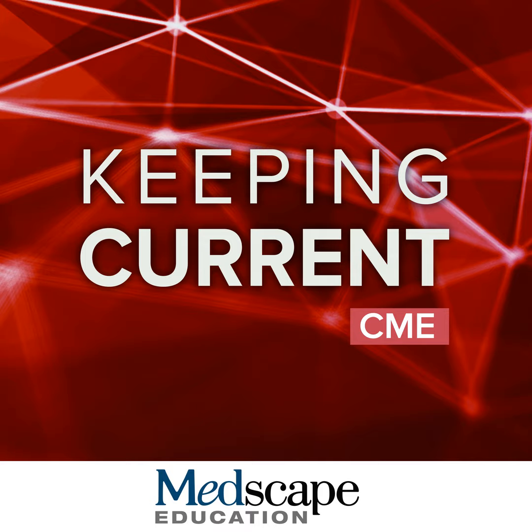So we can start by looking at this patient. This is patient 1. You can see that there's a 14-millimeter lesion with arterial phase hyperenhancement, washout, diffusion restriction, T2 hyperintensity. If we apply our LI-RADS table, we're going to fall into the LR-5 category. Very straightforward little HCC. Patient 2, very similar appearance.